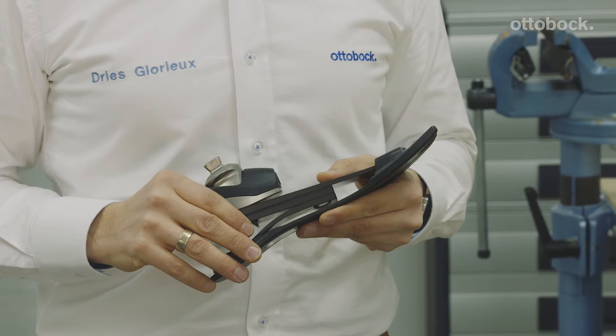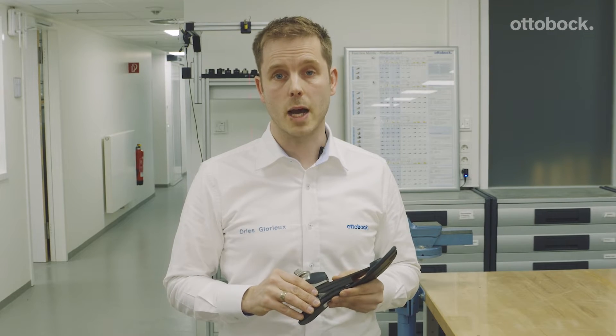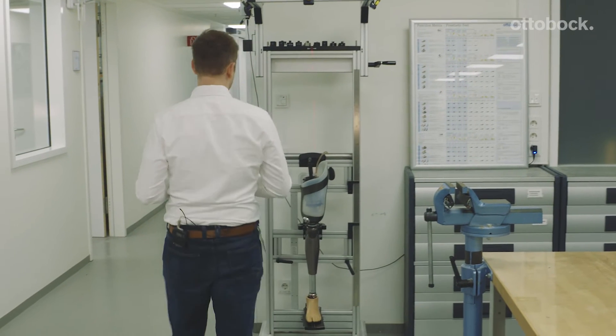Hi there, you may have heard about Triton SideFlex, the newest member of the Triton family. It's a Triton with an ML unit on top. We are today in the workshop and I want to speak a little bit about alignment, because the right alignment is really important for the end user. So let's have a closer look at a transfemoral alignment.